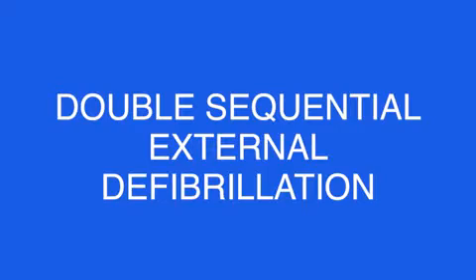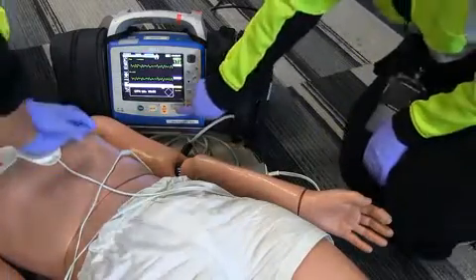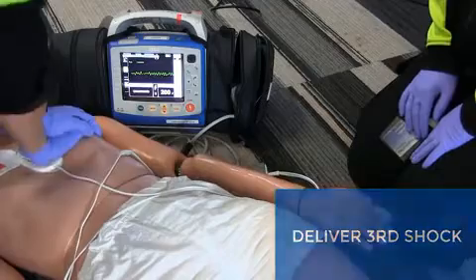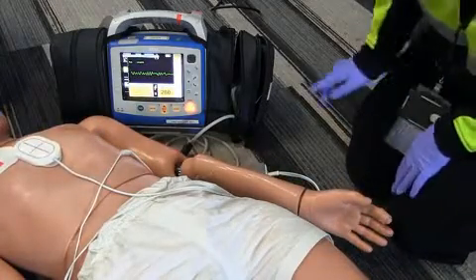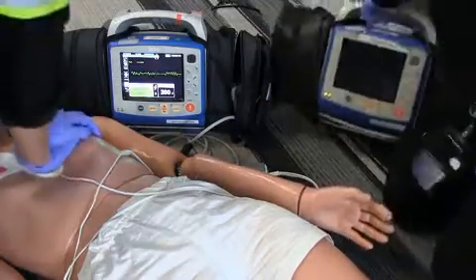This video will show how to perform a double sequential defibrillation using two Zoll X-Series monitors. Stop CPR. Let's analyze the rhythm. Patient is still in VF. Continue CPR. We're charging to 200. After your third shock has been delivered, prepare the second X-Series for double sequential. Okay, stop CPR. I'm clear. You're clear. Everybody's clear. Third shock delivered. The patient's now in the dose VF double sequential arm of the study.